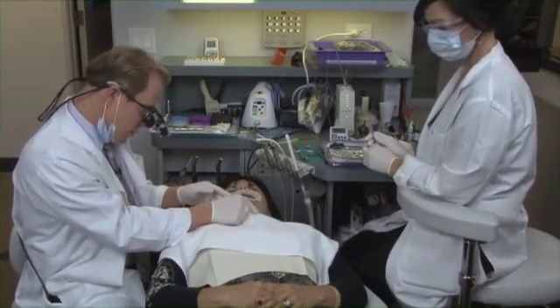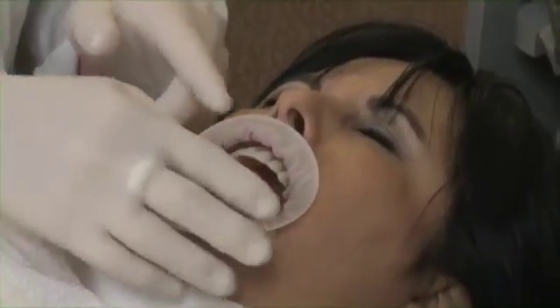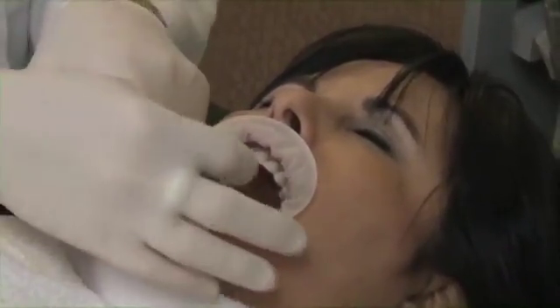Bite down, open, bite down, open. You can see how easy it is for her to open and close, and so we have complete access as we do our equilibration.